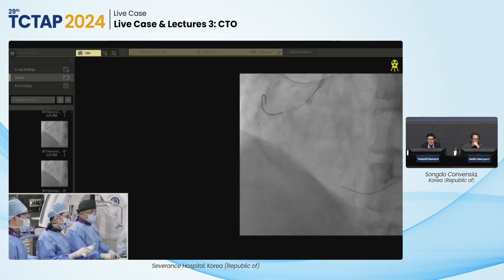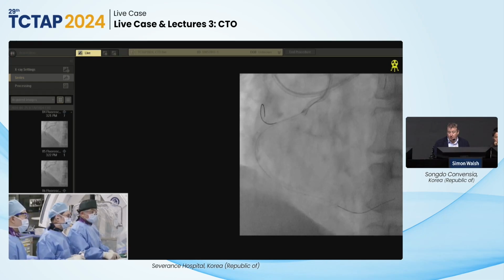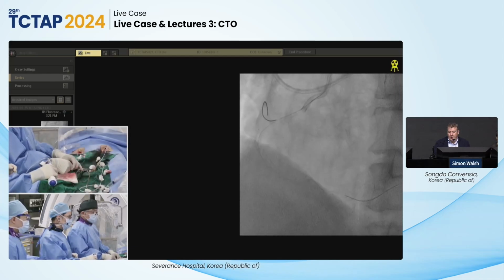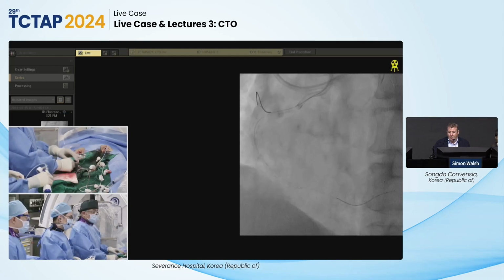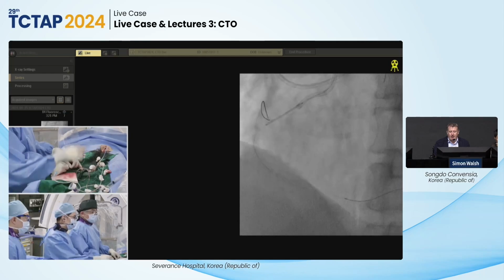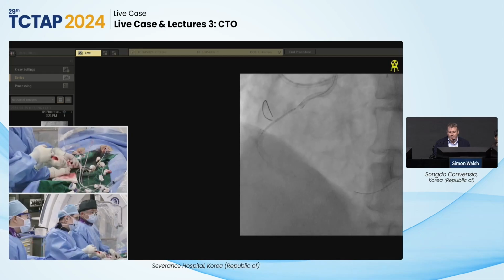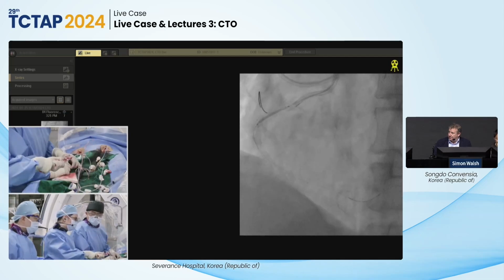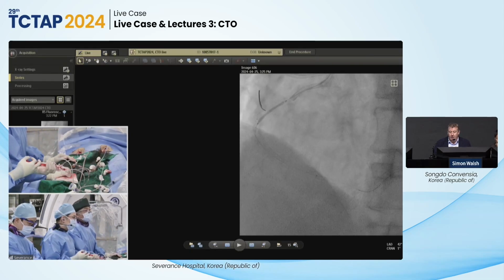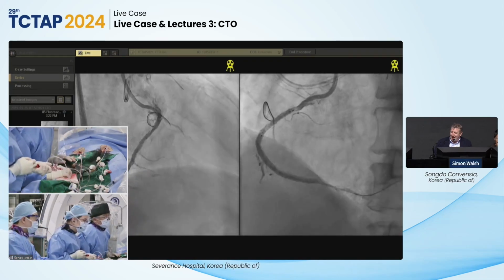I think it's important that we measure the distal stent landing zone diameter, post-dilation, and also the proximal as well, and that we assimilate the information that the IVUS has given us and make sensible choices from it. So measuring, because we've done a long pullback, we've got good information there, and we should make decisions based on measurement in terms of stents and post-dilation. The DCB question's an interesting one. I'm the same as yourself, Kambis. I would use a lot for distal runoff, especially if it's not calcified plaque. The question is, are we treating the angiogram or are we treating ourselves?